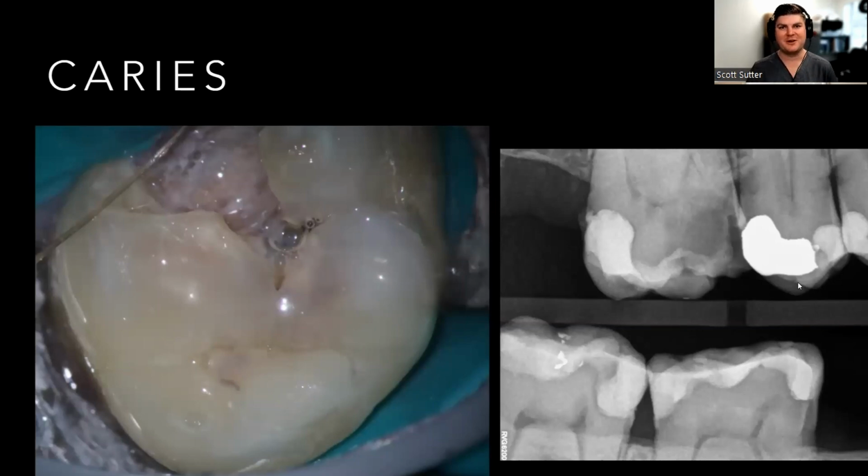Yeah. When you reduce your occlusion, do you round off the edges of the teeth? Yeah, I use that barrel burr. It looks like a big old diamond like this. And that is perfect for that sort of thing. I can get you guys the number, but it is one of my most used burrs. I discovered it when I was working at a different office and they had it. And I was like, oh my gosh, this thing is amazing.